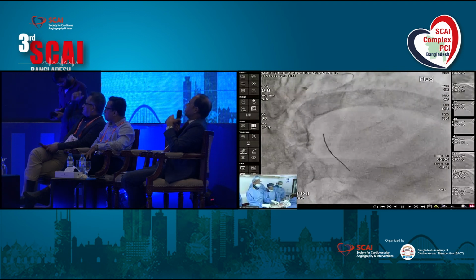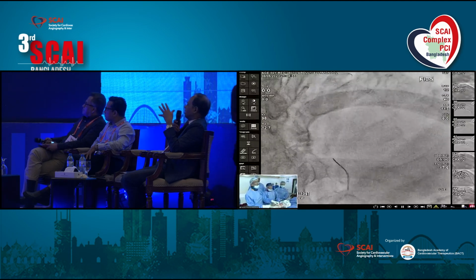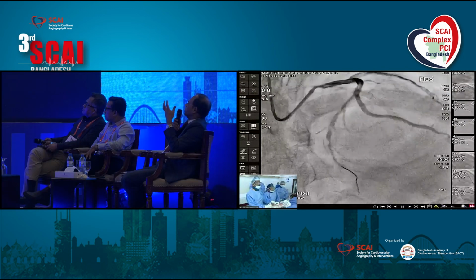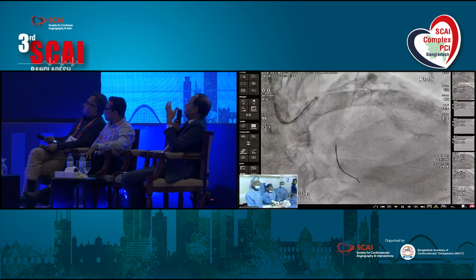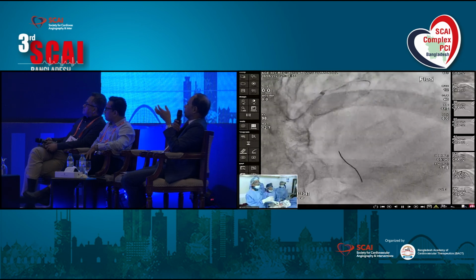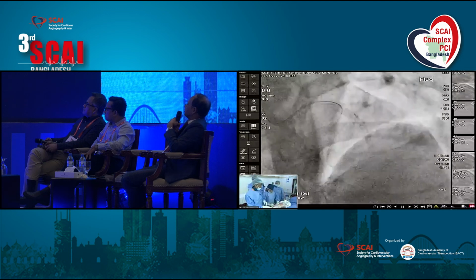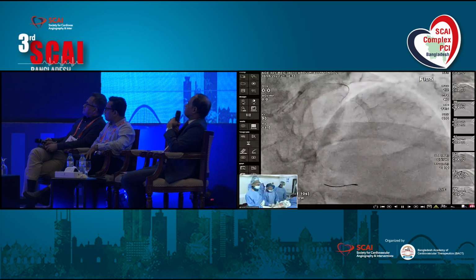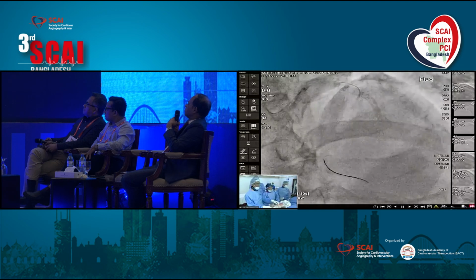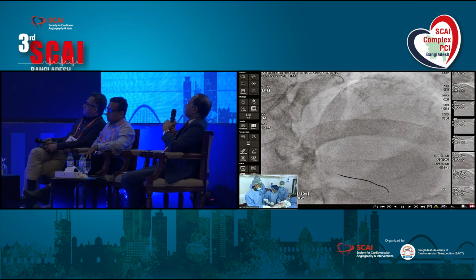For LAD, if we don't do the IVUS in such a case, I used to do 3.5 millimeter post dilatation. So angiographically that will look good, but definitely IVUS gives the better assumption that 4 millimeter is the perfect size. You're right, Dr. Datta, once you do so many IVUSs, probably you'll be okay to oversize or accurately size the balloon.